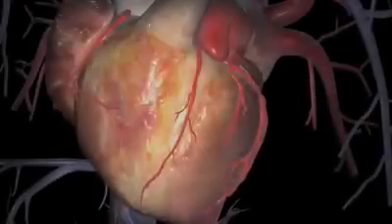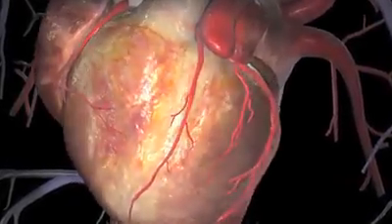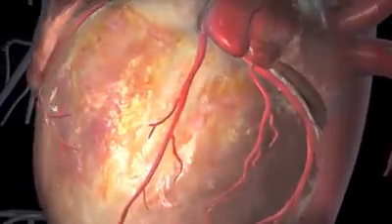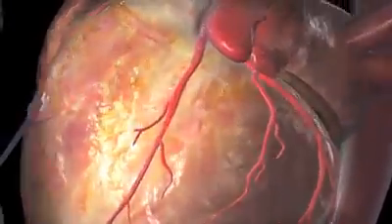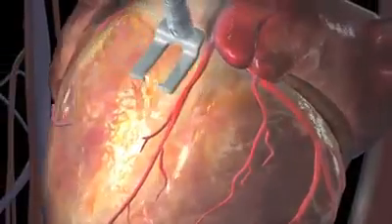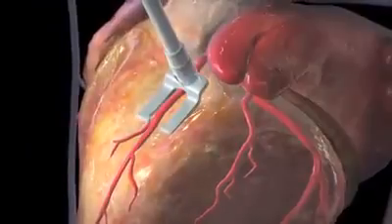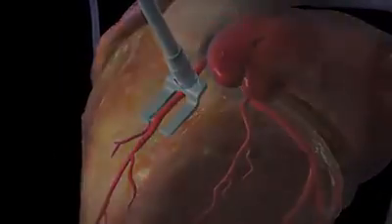Some bypass surgeries are done without a heart-lung machine. This operation is called beating heart bypass grafting because the heart isn't ever stopped. Instead, a mechanical device steadies just the part of the heart where the surgeon will attach the graft.